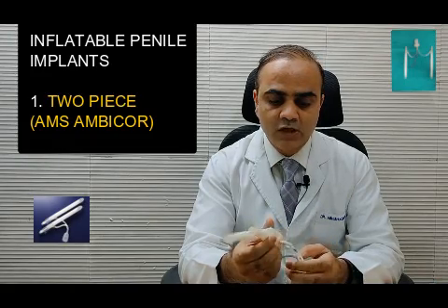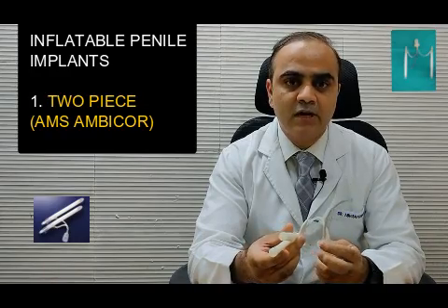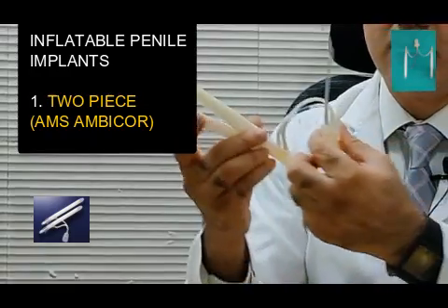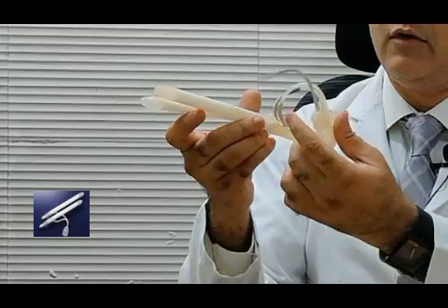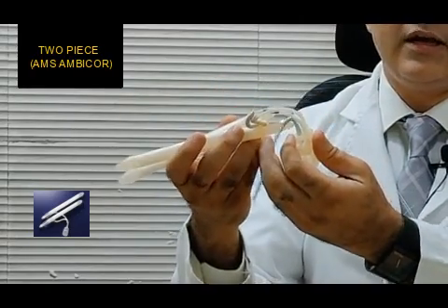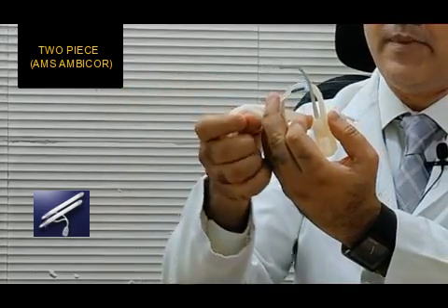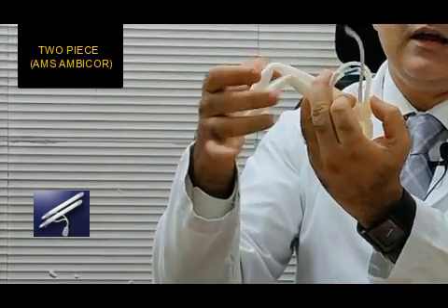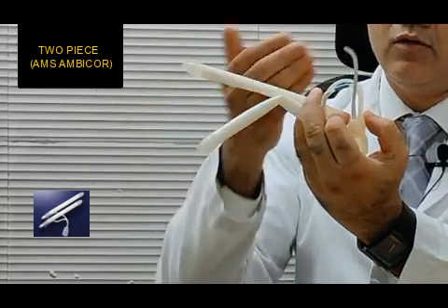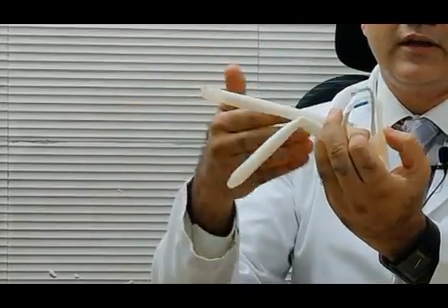So this implant works by the mechanism that whenever you want an erection, you just press this button. Once you have pressed this button, the fluid from the reservoir goes into the rods, and you have an erection, a rigid erection. And then once you are done, you just bend your penis like this, and the fluid from this goes back to the reservoir, and that completes the act of the erection.